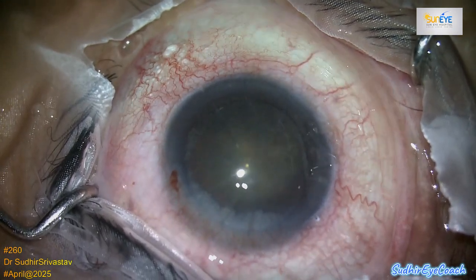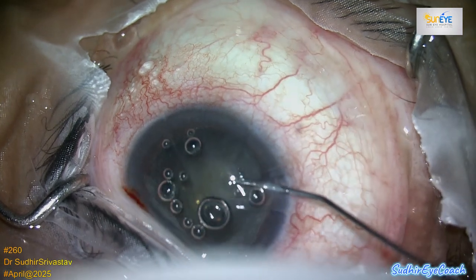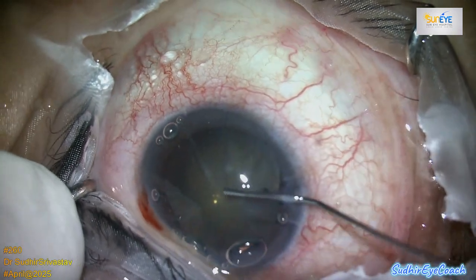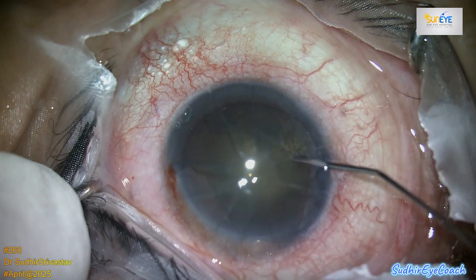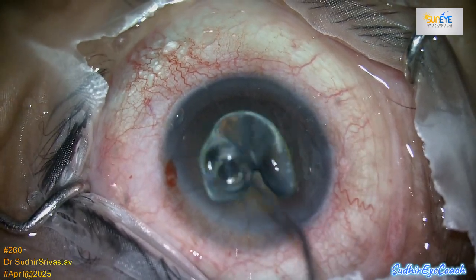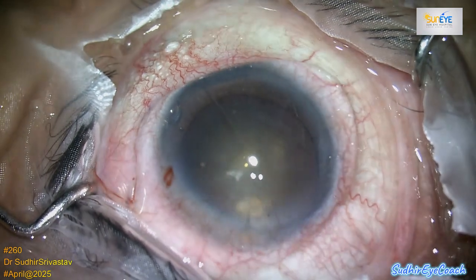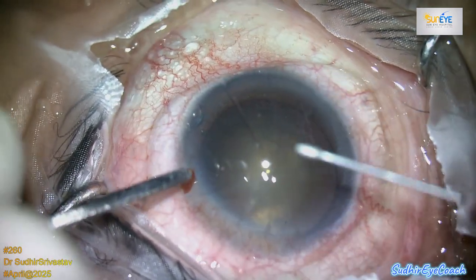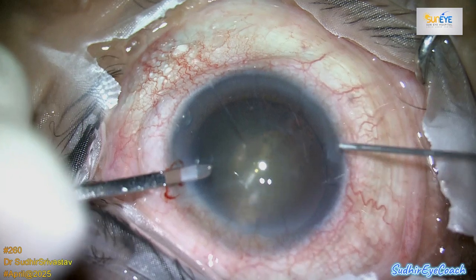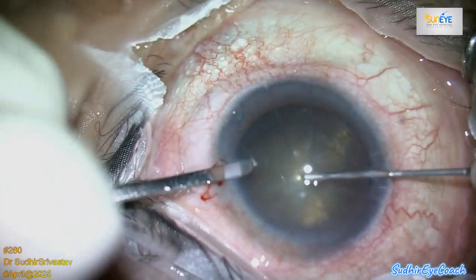Phacoemulsification proceeded uneventfully. However, due to prior vitrectomy, these cases often present with anterior chamber fluctuations during surgery. To manage this, it's crucial to lower the bottle height in a gravity-fed system, or reduce the infusion pressure if you are using an active fluidics system, and always proceed slowly and calmly.